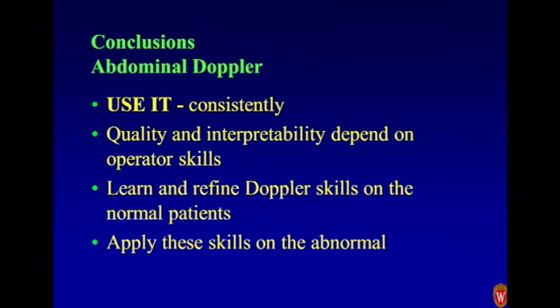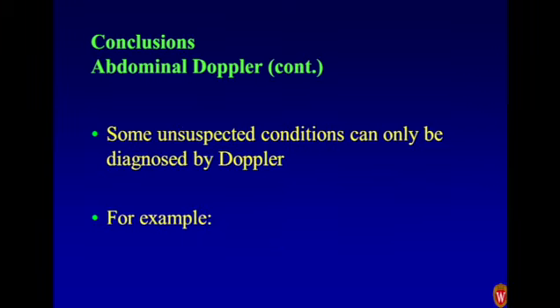Use it. Don't wait for somebody to order it. You have to keep your skills up. All right? If somebody asks you to do Doppler because it's a very complicated case, it's not going to be easy to do. You want to learn and refine your Doppler skills on normal patients. If you have a few minutes between patients, play with it. Make sure you know it, and then apply these skills on the abnormal patients.